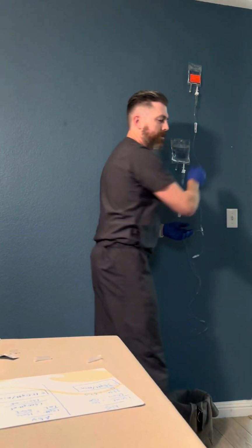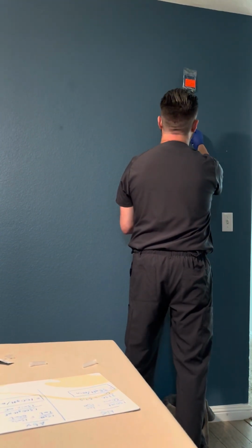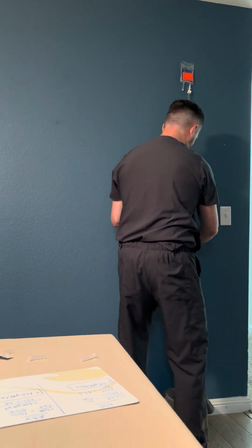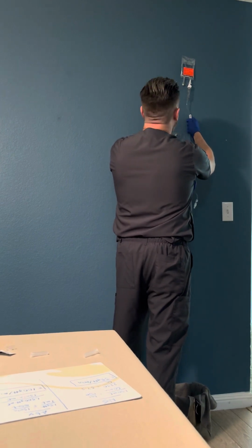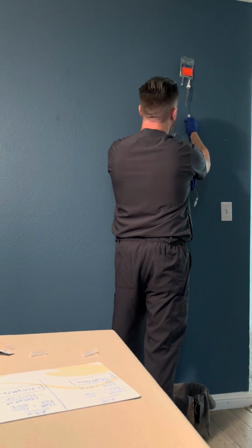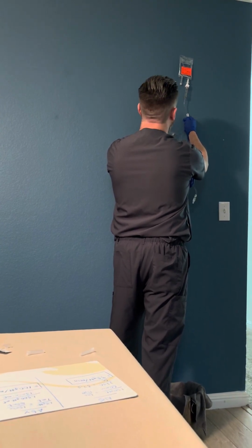And we're going to count out the 100 drops per minute. Fastest time, and starting now.